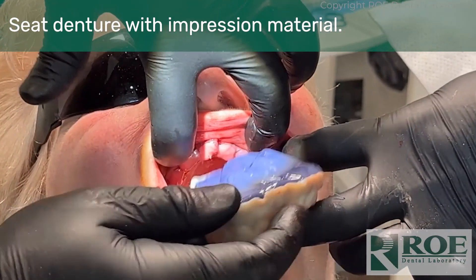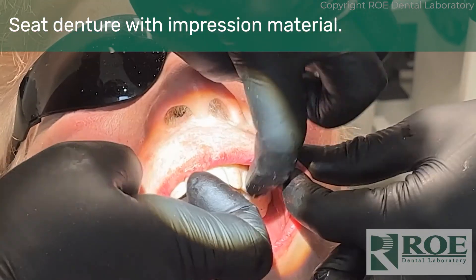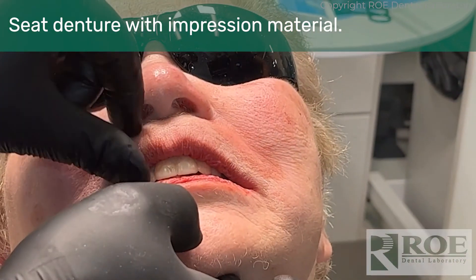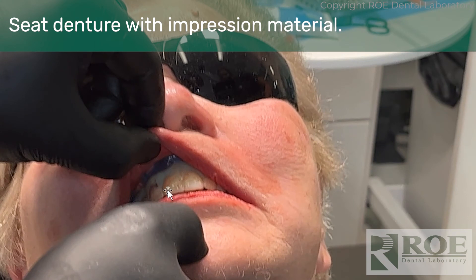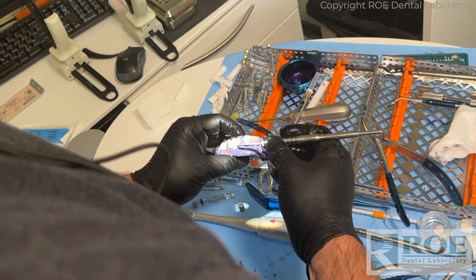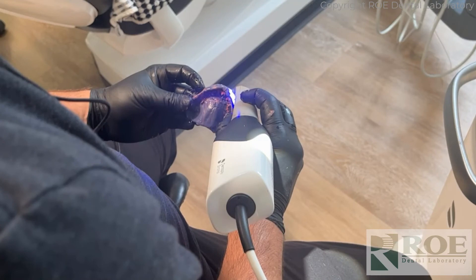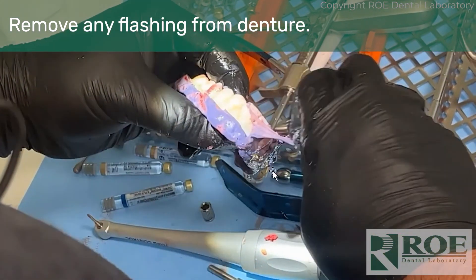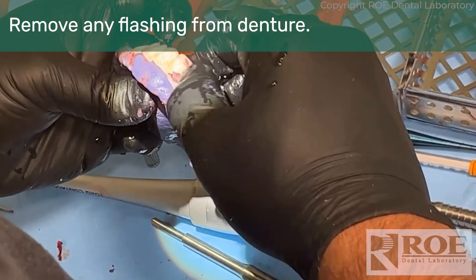Seat the denture using normal denture protocols. Remember, the inside of this denture was tried in beforehand — you don't want the denture touching any of the scan bodies and holding it up or manipulating the bite. The palate needs to fully seat, and the inside would need to be adjusted until the denture seats. Then it's loaded with impression material, the patient is put in bite with a fast-set material, the midline is checked, the denture is rotated if needed, and then you wait. When it comes back out of the mouth, it is scanned. Trim away any flash so you only have material on the intaglio — that way we can see the teeth.